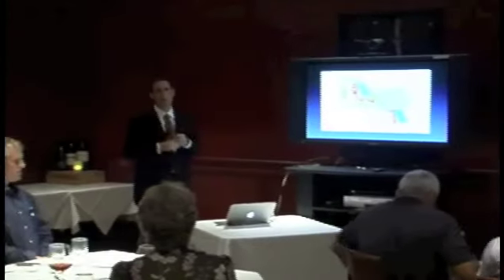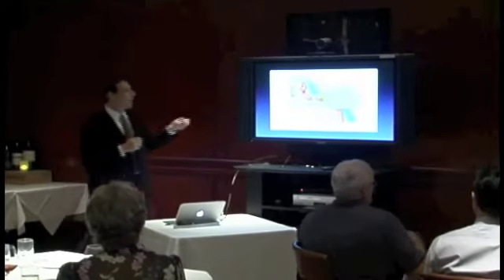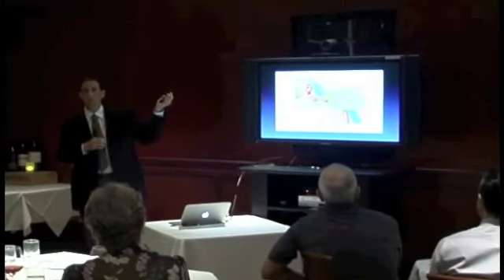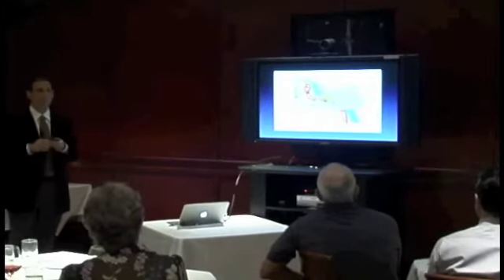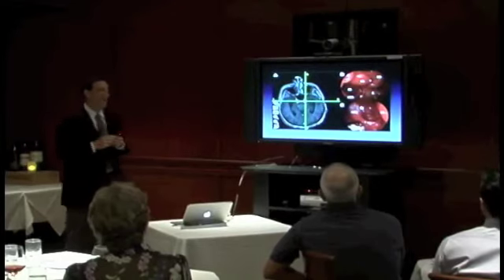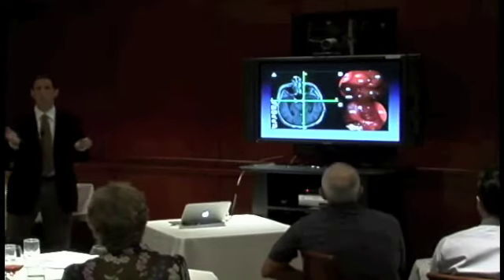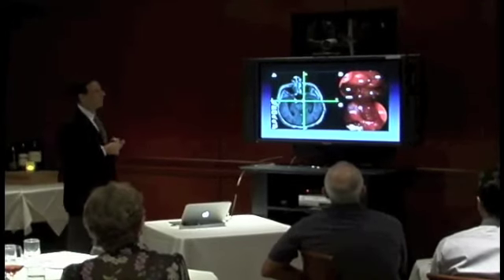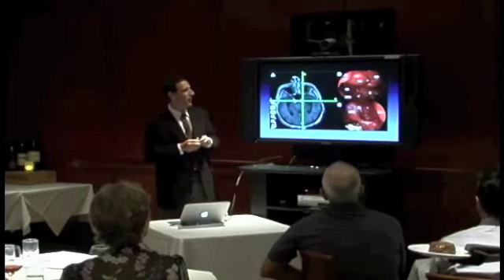You can also start to go more lateral with these kinds of tumors. So we know where the carotid artery is. We know where the pituitary gland is. We have image guidance to tell us where the structures are. You can start to get to cavernous sinus lesions as well, which has often been considered taboo in surgery because of morbidity. Here's a lady that had a right cavernous sinus tumor. She had no other known primaries. She's developing double vision. Her symptoms were progressing. And so we said, well, we think we can get there. She had wide open sinuses, and so we thought we could get a path.